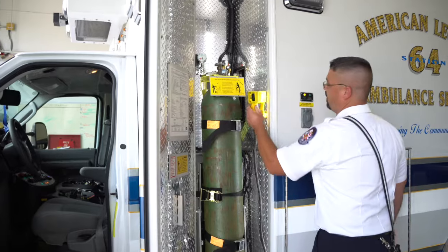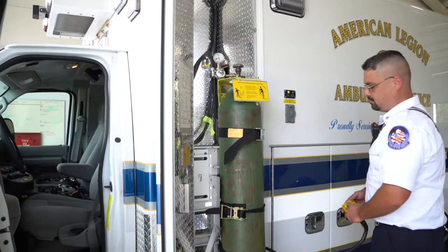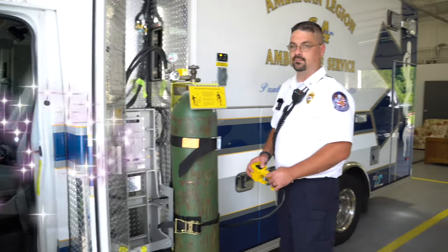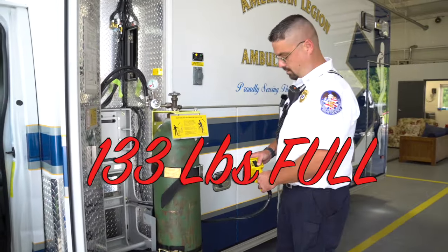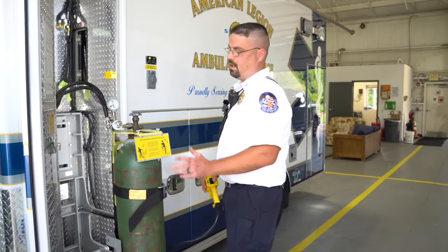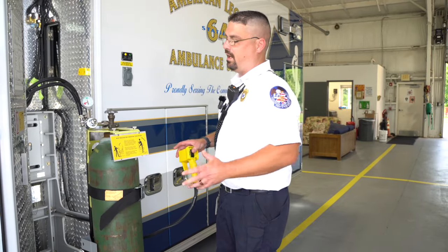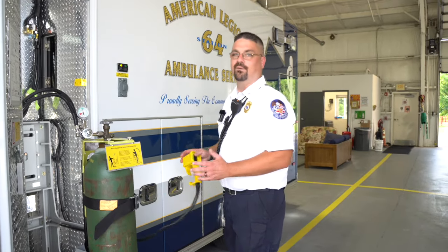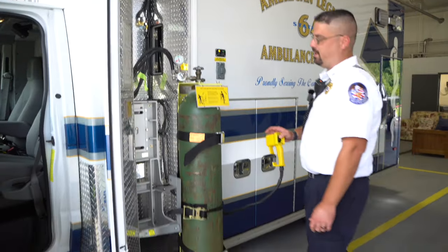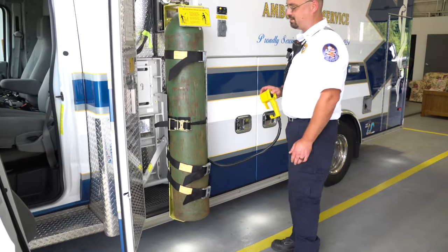Just reaching up and unlocking it — there's a safety lock. Each of those tanks, when full, weighs probably 75 to 100 pounds. This way we can safely secure it with straps so it doesn't become a missile in an accident. And again, with the easy push of a button, we can load it back in — doesn't hurt our backs. My back feels much better watching this do all the work.